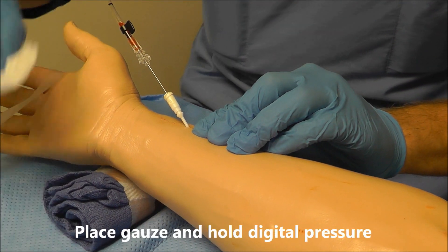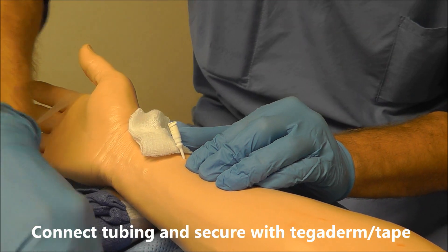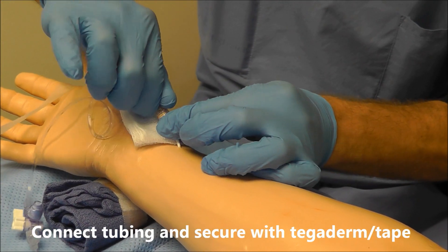From this point, all I need to do is place gauze, hold pressure, remove my wire, and hook up — and we're done.